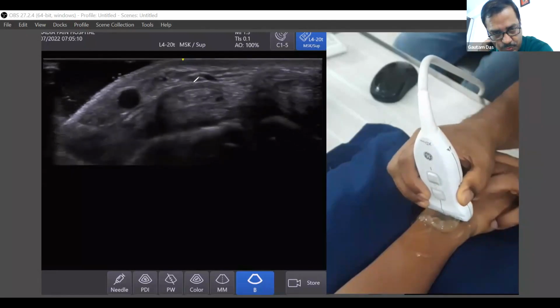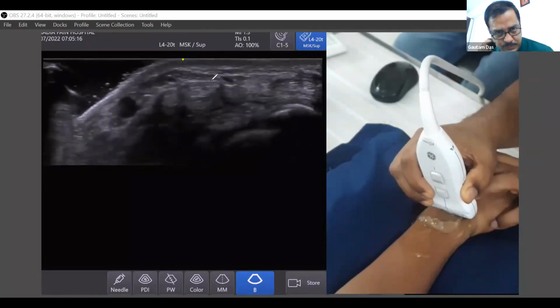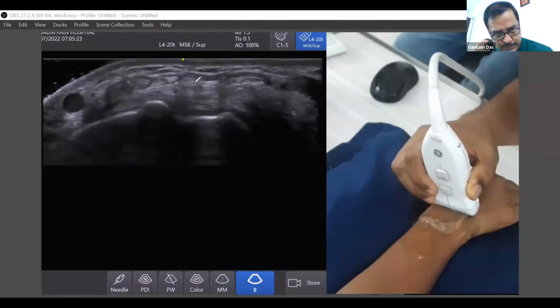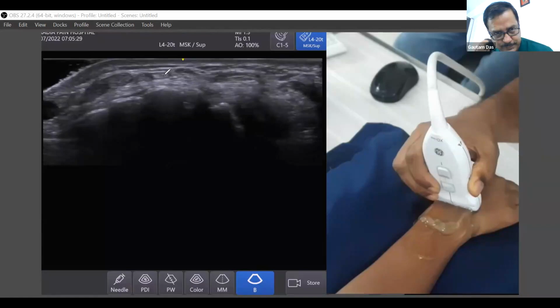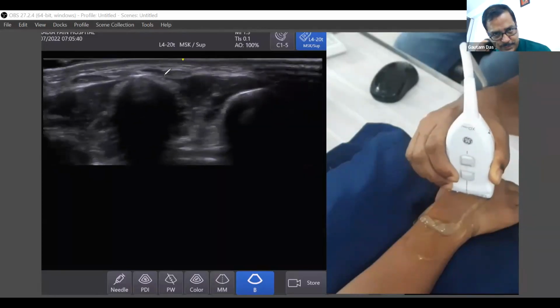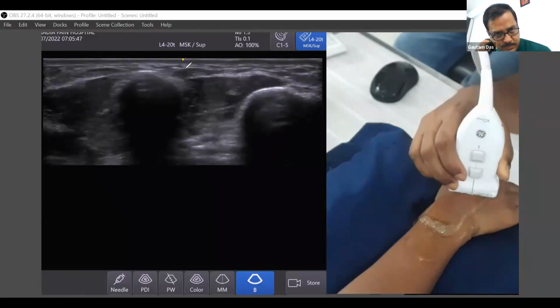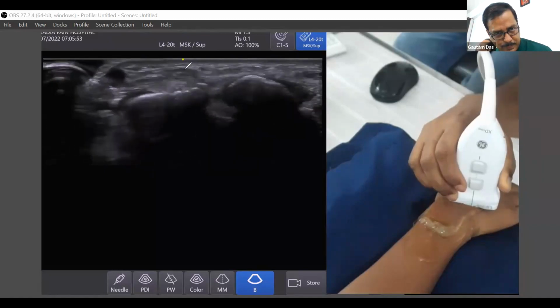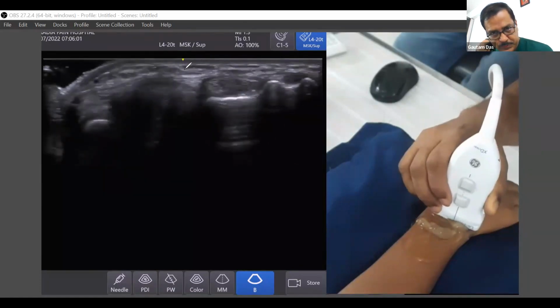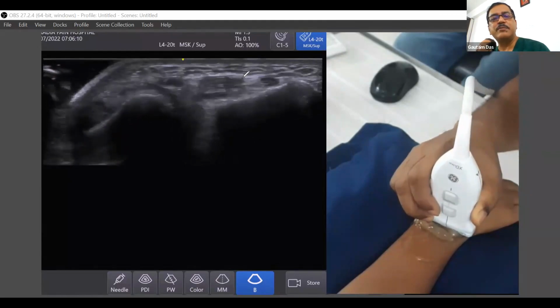And now, the tendon which is supplying the index finger is joining with this. Just follow this middle one here. And you see what is happening. This tendon should be coming towards the index. You see, now it is slipping, and now it is coming towards the index finger. Again, coming back. Yeah, back. So this index is supplied by two extensor muscles. One is coming from the extensor digitorum, another is coming from the extensor indicis.